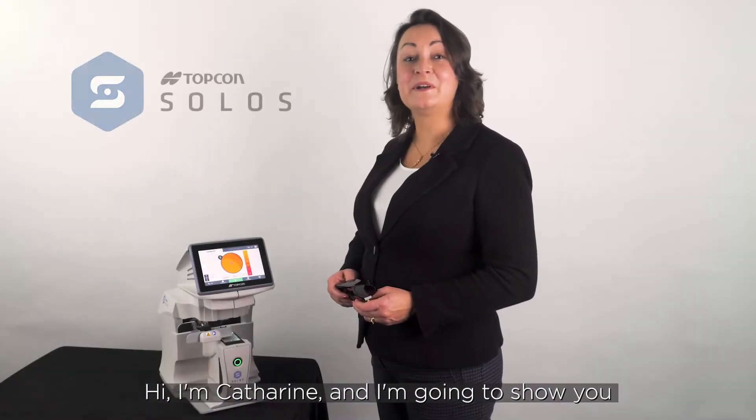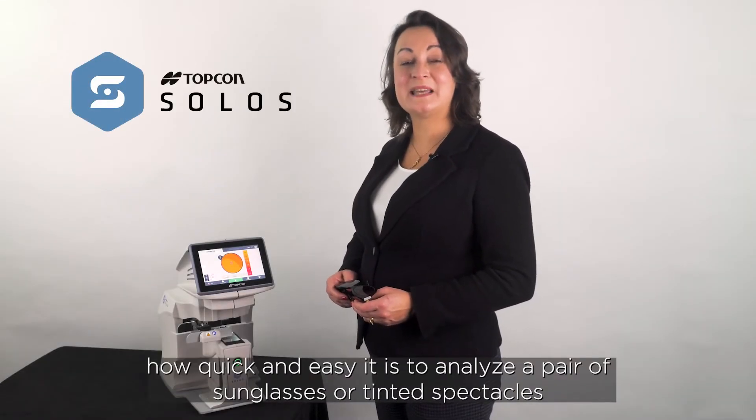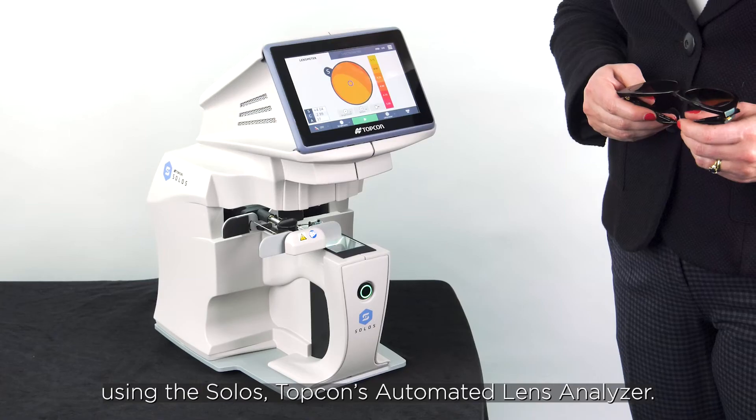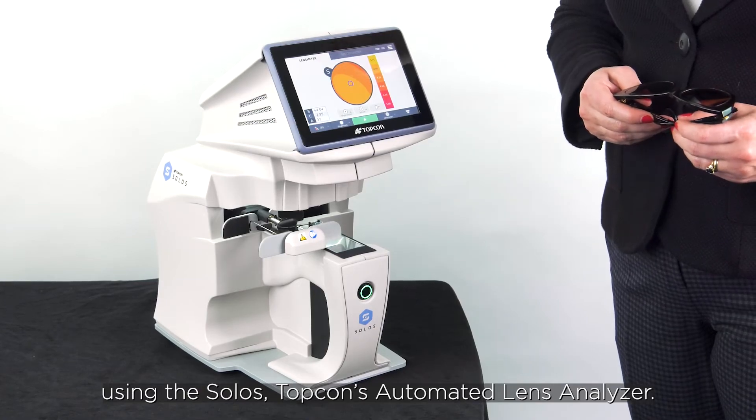Hi, I'm Catherine and I'm going to show you how quick and easy it is to analyze a pair of sunglasses or tinted spectacles using the Solos, Topcon's automated lens analyzer.